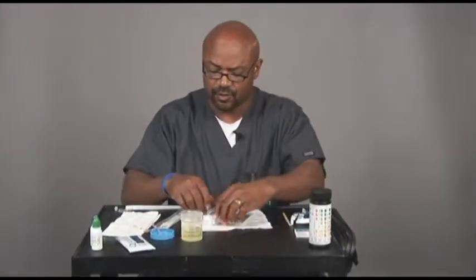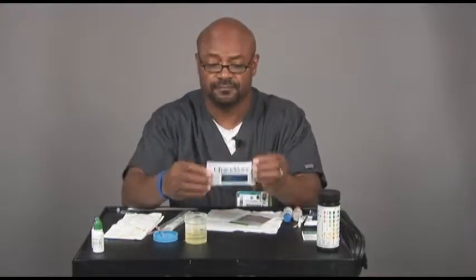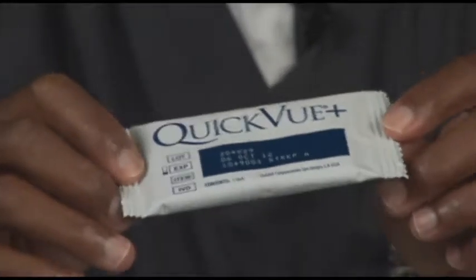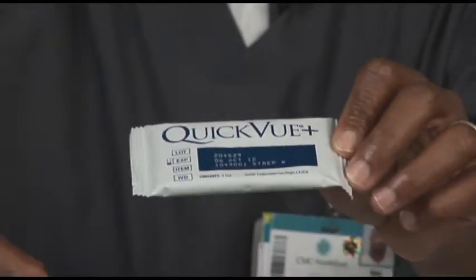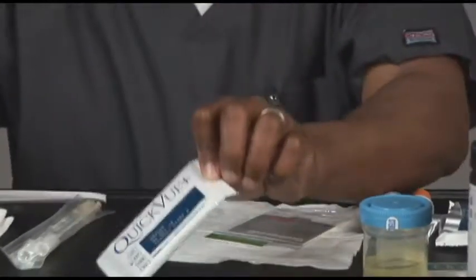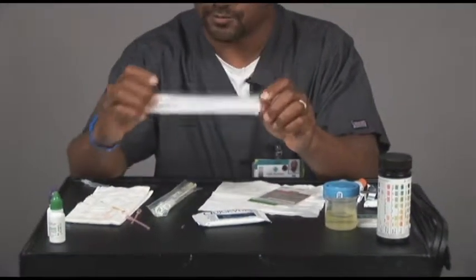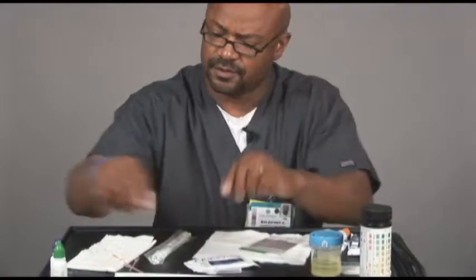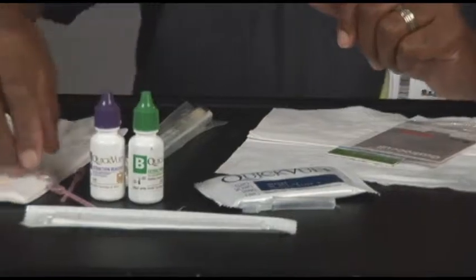Next test we do quite often in our department is the rapid strep, which you have to be careful. The package is similar to the urine pregnancy test, with the exception it has strep A down at the bottom. For that test, you would need a cotton swab, as well as a plastic test tube with a dropper top to go with that, and reagents B and A or A and B.